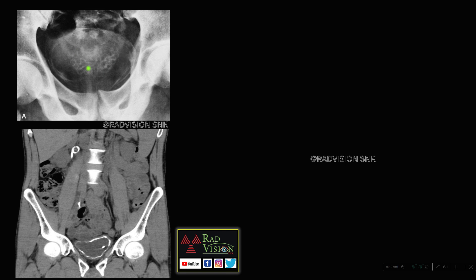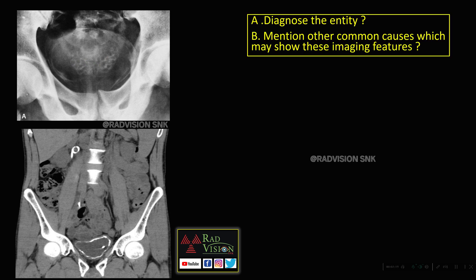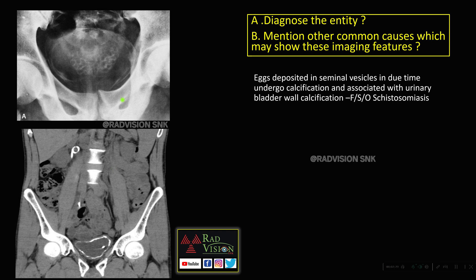Coming to the next case: in the seminal vesicles there are multiple lucent defects with eccentric rim calcification, and there is bladder wall calcification. This is also confirmed on CT where you can see bladder wall calcification. Whenever you see bladder wall calcification with multiple seminal vesicle calcifications and lucent defects, definitely suspect schistosomiasis. The lucent defects are nothing but eggs deposited in the seminal vesicles.